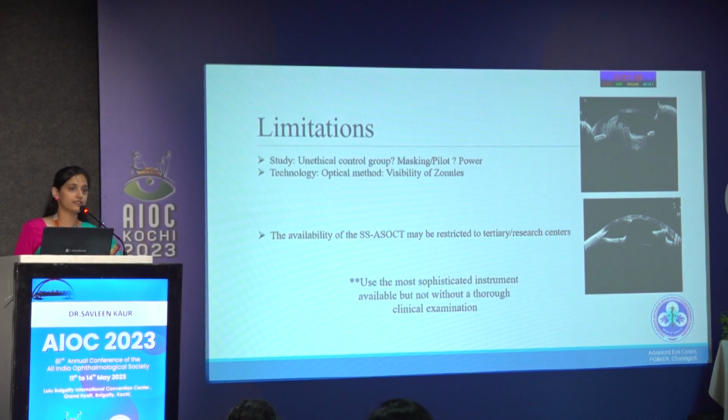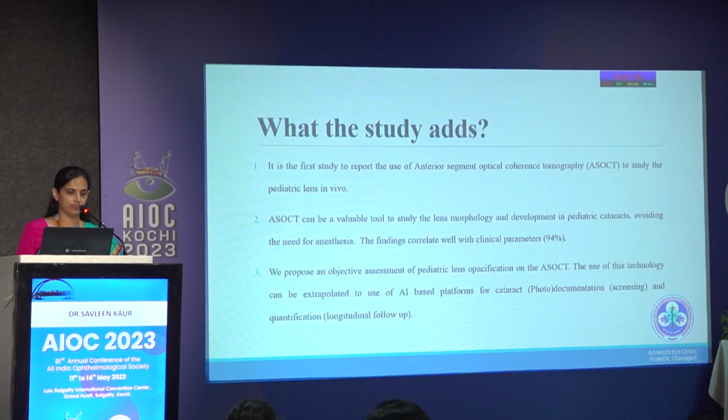And the availability of the technology of the ASOCT is also limited to maybe tertiary or research centers. We cannot replace a complete examination by a sophisticated instrument, so the gold standard is still a clinical examination. Nevertheless, our study is the first to report the use of ASOCT to study the pediatric lens in vivo.